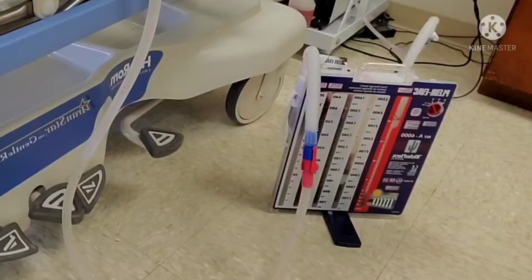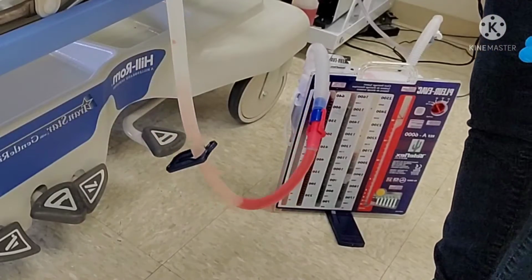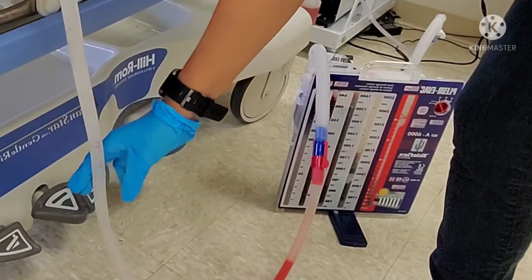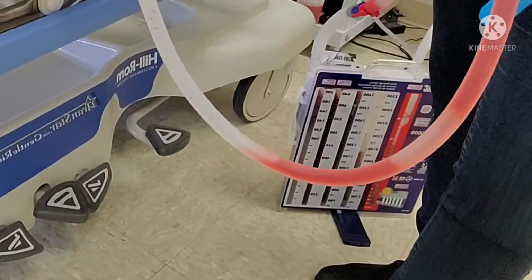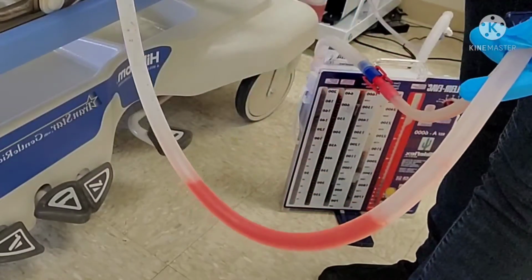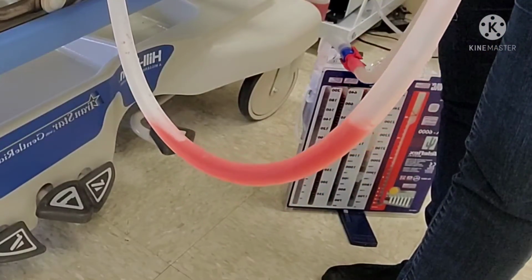Now, if we look down at the tubing, I have to kind of pull it up a little bit for you. You notice that I have something in my tubing. Now, what is this in my tubing? Can you guys see that? Being very careful, because I do not want to lift this tubing up so that this blood goes into my patient. But I have blood here, and I don't want it there, okay? Because what happens is that this blood will eventually clot.